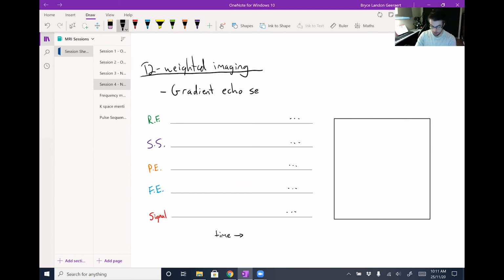So it's a gradient echo sequence, usually. That can be abbreviated as either GE or GRE. The R stands for recalled, so it could be gradient echo or gradient recalled echo. Worth noting that this GE is a separate acronym from General Electric, who makes MRI scanners.